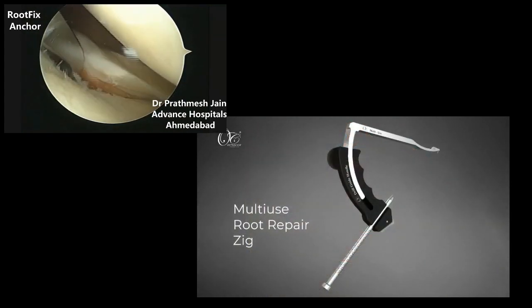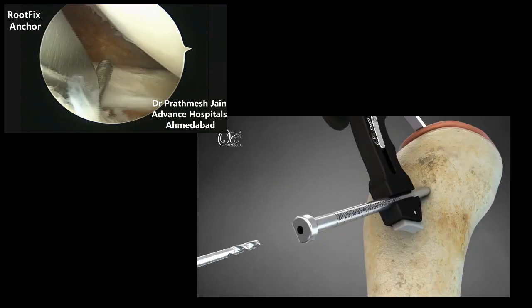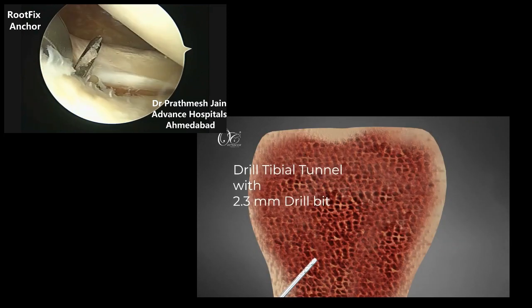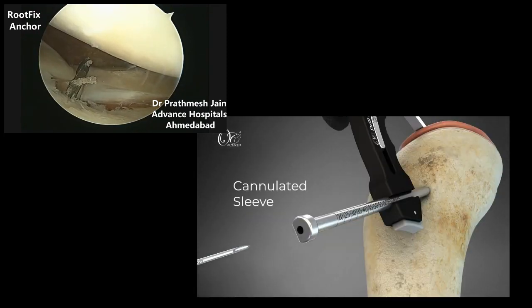Now place the OsteoCare Multi-Use Root Repair Zig. Then drill a tibial tunnel with a 2.3 mm drill bit, and place the cannulated sleeve in the tunnel through the angled bullet of the zig.